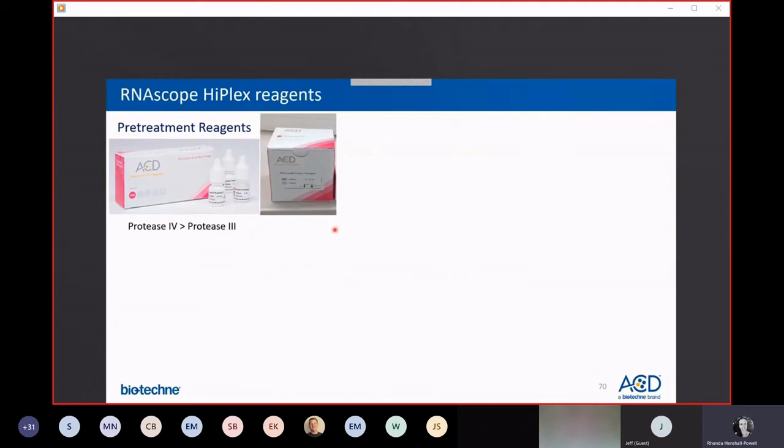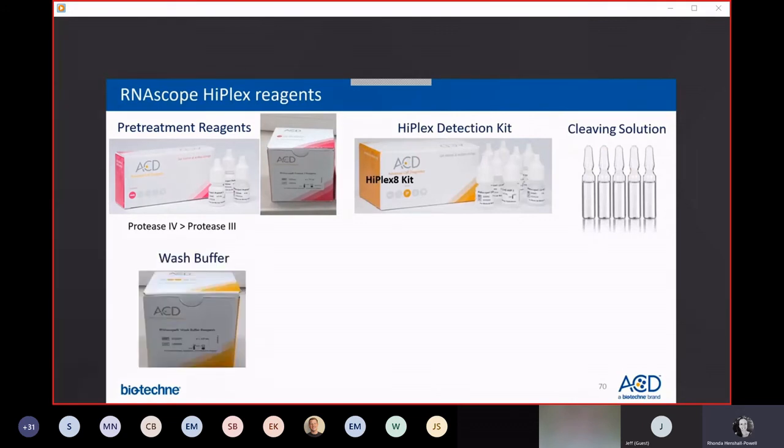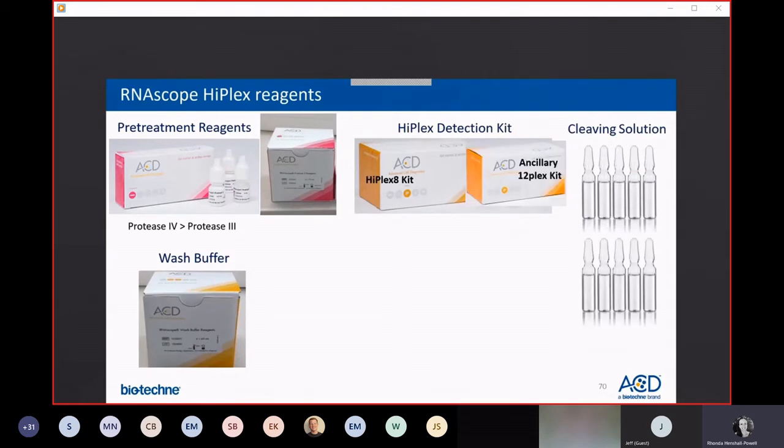There's also a target retrieval buffer. If you have fixed frozen tissue, you'll need to do a short, just 5-minute boiling step with target retrieval buffer to retrieve the RNA from the crosslinks formed by the formaldehyde fixation. A HiPlex detection kit by default comes with the 8-plex capability, and this comes with cleaving solution that you use to cleave off the fluorophores in between rounds of imaging. There's a wash buffer you'll use in between all of the hybridization steps to wash away any unbound oligonucleotides.